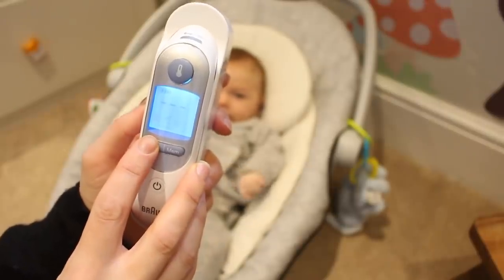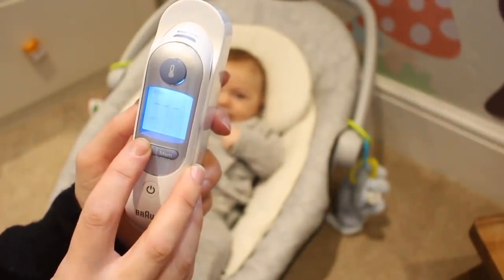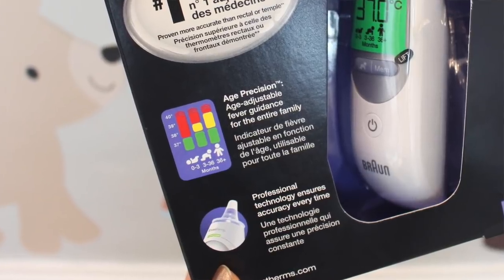Using the thermometer is super simple. You start by selecting the age of your baby or child, which then cleverly alters the fever detection range using age precision technology.